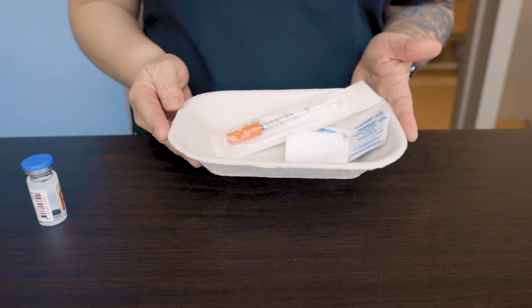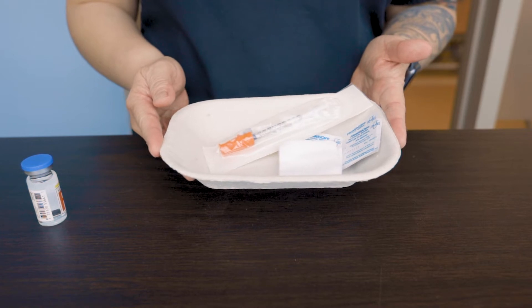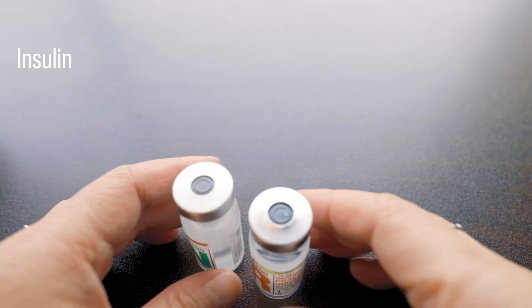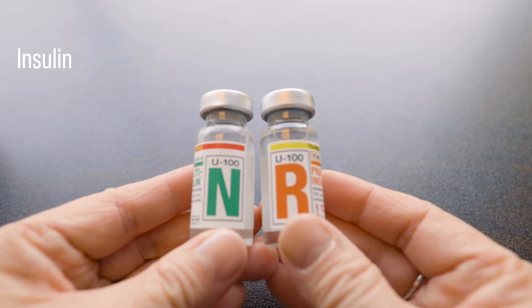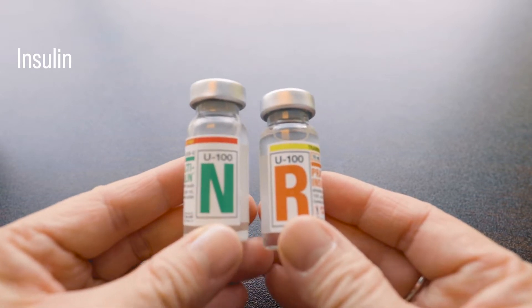Hello everyone. Here's a brief demonstration on how to mix insulin in one syringe. For this, we will need the following supplies. Here we have a regular acting and an intermediate acting practice insulin vials.